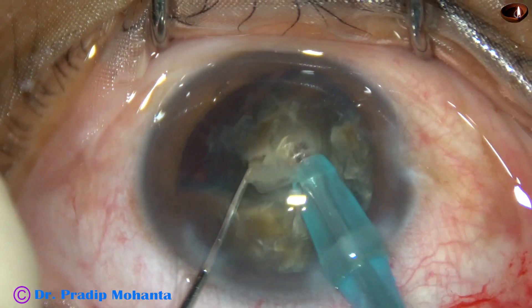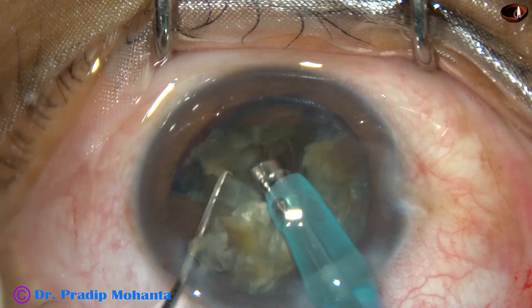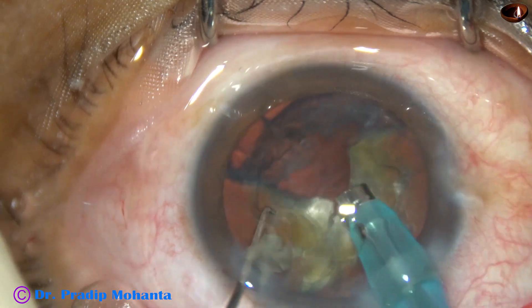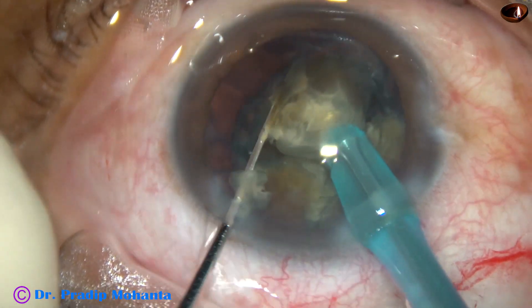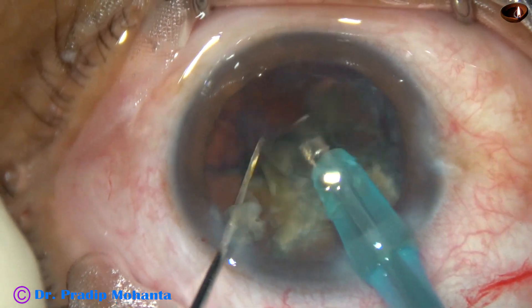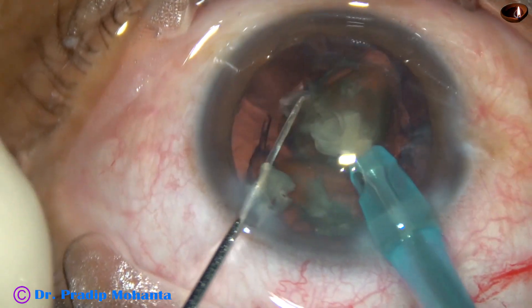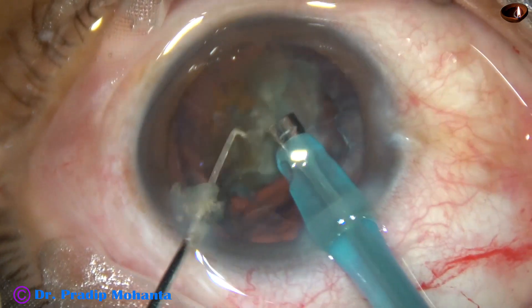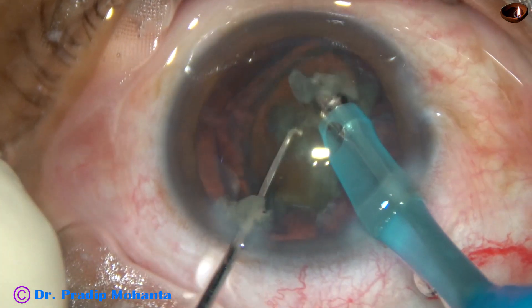Each large fragment is tilted and emulsification of these triangular large fragments is started from the apex. Use the chopper and the phaco needle to tilt it and start emulsifying from the apex. Why from the apex? Because it is sharp and pointed, and if it goes towards the posterior capsule it will exert pressure on a particular point — and if there is too much pressure, there is a possibility that the posterior capsule will give way.